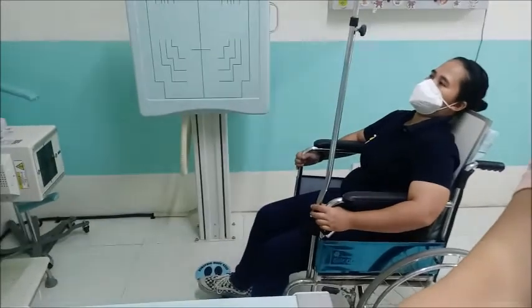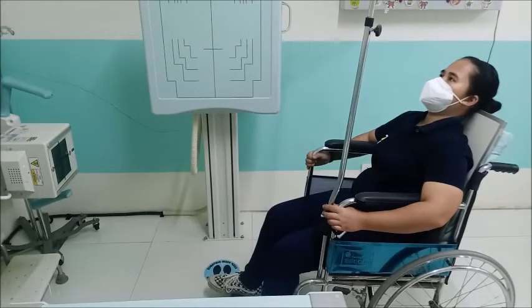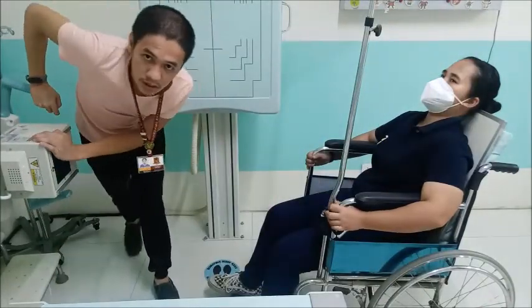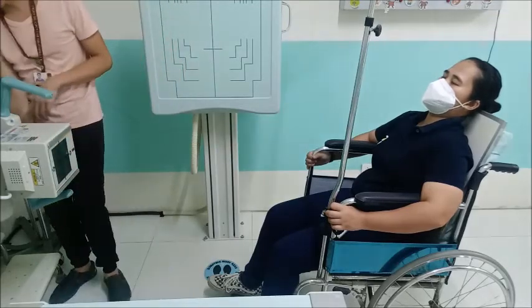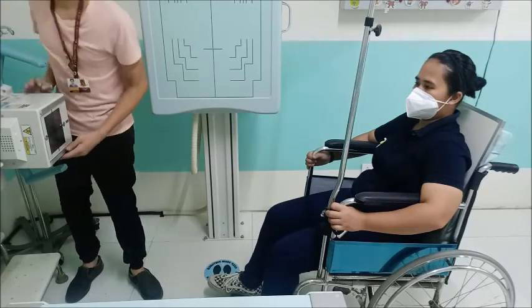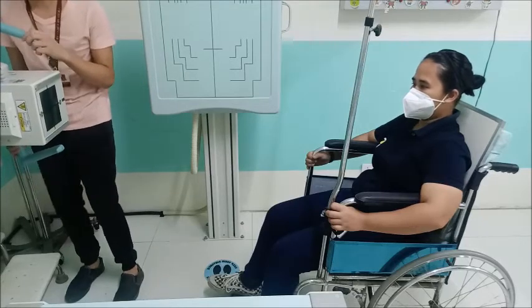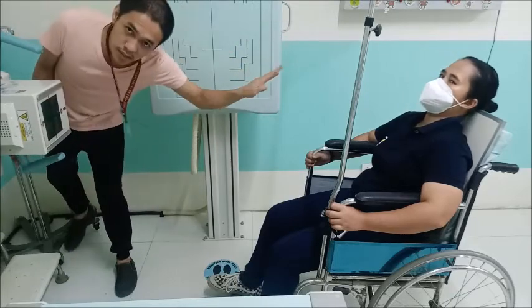The difference between AP and PA examination of the chest for those with pathologic conditions in the respiratory system or thoracic area: other than the projection, AP or PA, the entrance and exit, there is also the SID. For chest PA, it is 72 inches SID. For chest AP, only about 40. There is a measuring tape attached to the X-ray tube, and you can also use a meter stick if available.